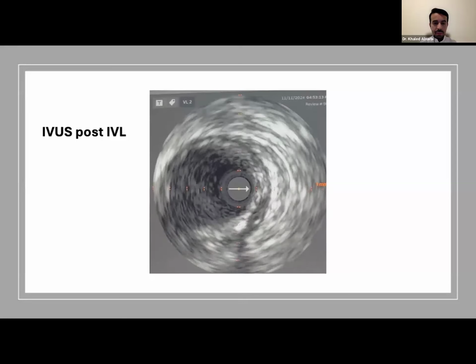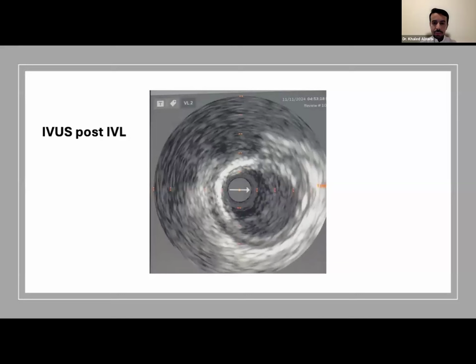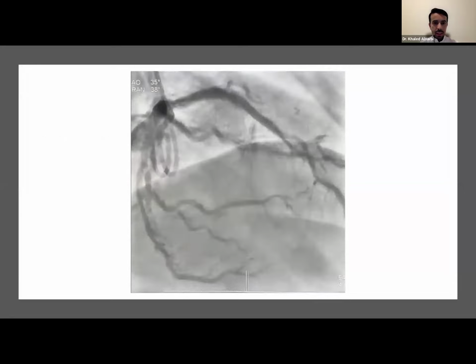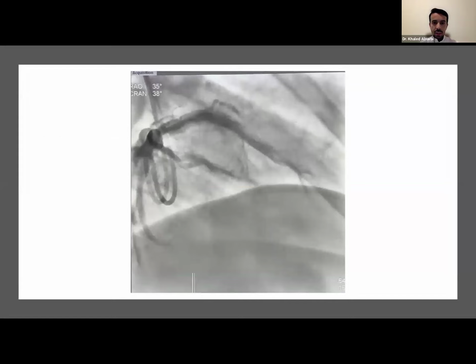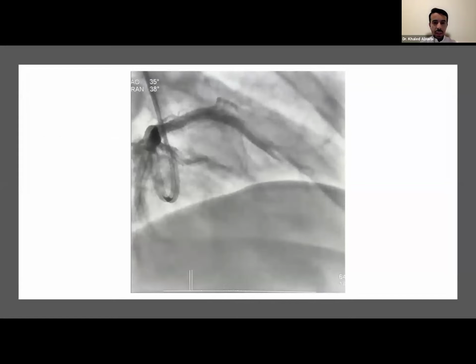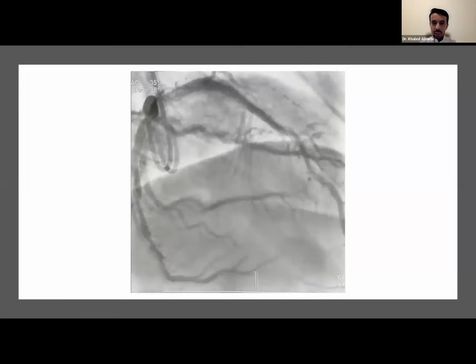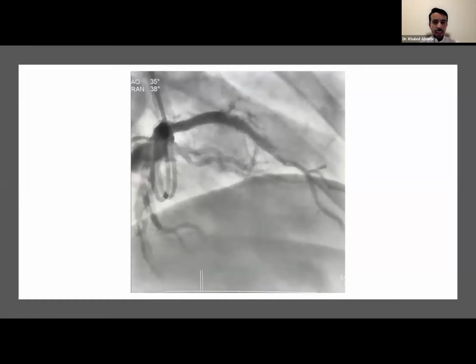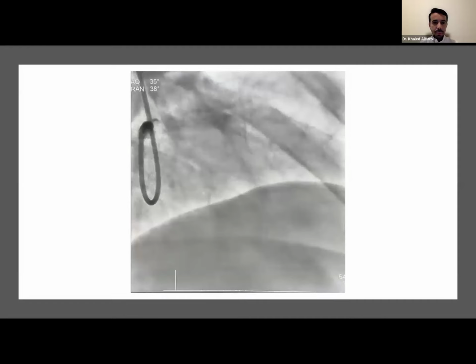And also we have a good landing zone approximately just before the left main. And this is the result after drug-eluting stent. So here I used a 3.5 long stent. We just post-dilate with the 3.5 distally and 4.0 proximally. And then we did IVUS just to make sure the position, the distal, and if there is any distal or proximal edge dissection.